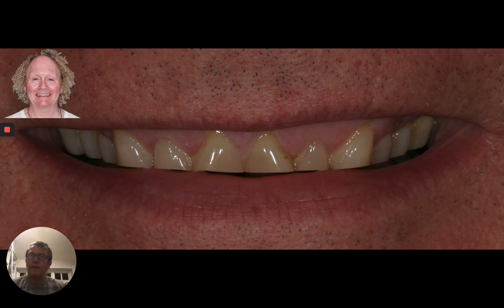So once we've got both of those things, and we've got a stable bite, and we've also got the patient interested in maybe creating a beautiful smile as well, then we can also look forward to moving from two-dimensional to three-dimensional, and we can convert that two-dimensional smile design into a three-dimensional smile design or a trial smile that we can actually try in over the patient's teeth so they can really see how this could look for them. But not just so that we get the aesthetic result that they'd like and that we'd like, but also how we can use that to gain functional information as well.